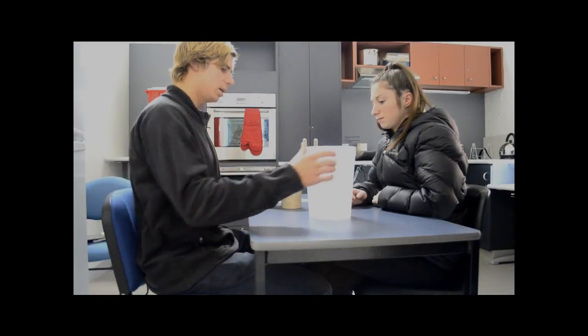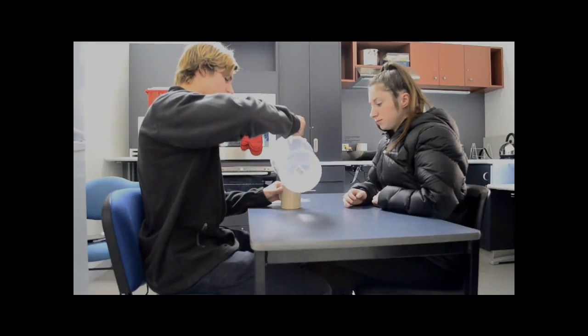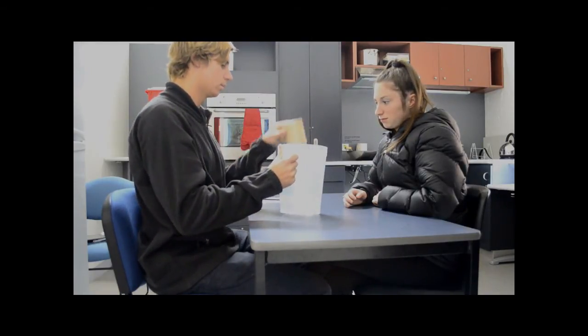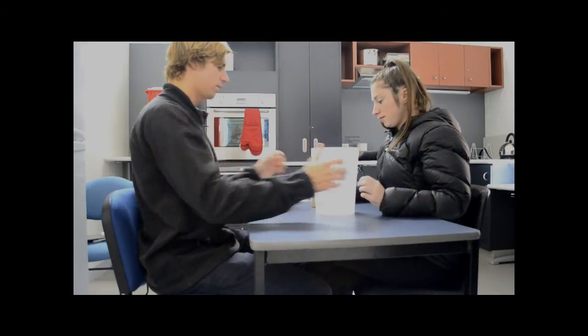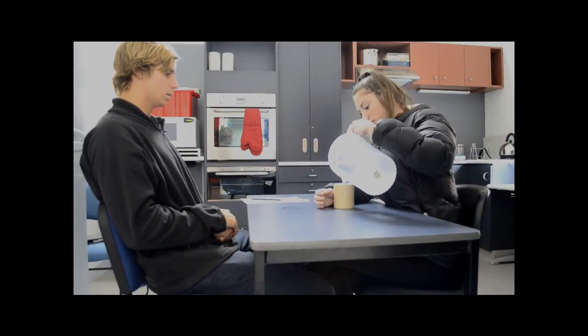Okay, Norma, for the next activity, what I want you to try and do is to grip this mug, however you please, and pour yourself a glass of water. There we are. Can you do that for me? Yeah. Good.